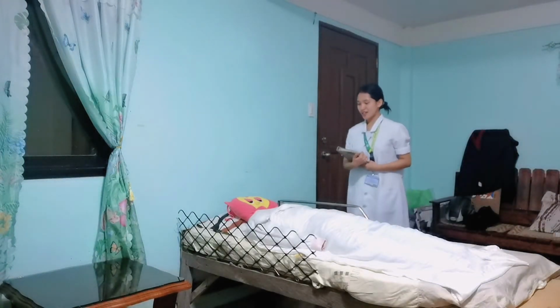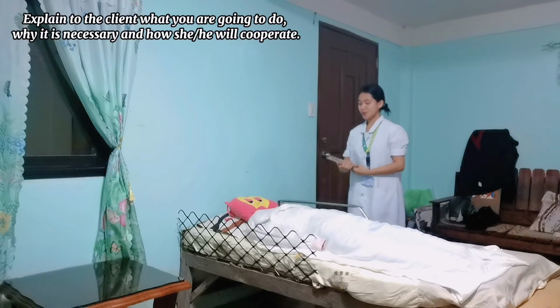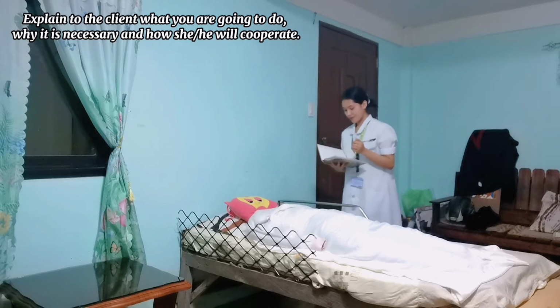Good day, sir. I'm Riza Agapi Siyabut, your student nurse for today from San Pablo Colleges. So, for today, sir, I am going to do your bed or perform bed making. Is that okay to you? Okay, thank you. So, sir, may I know your name po?